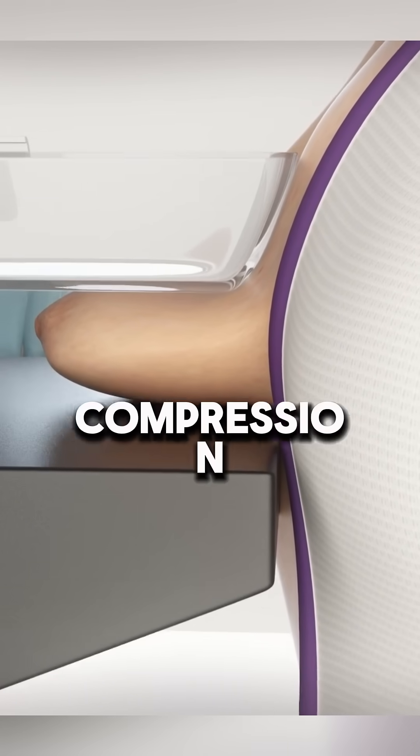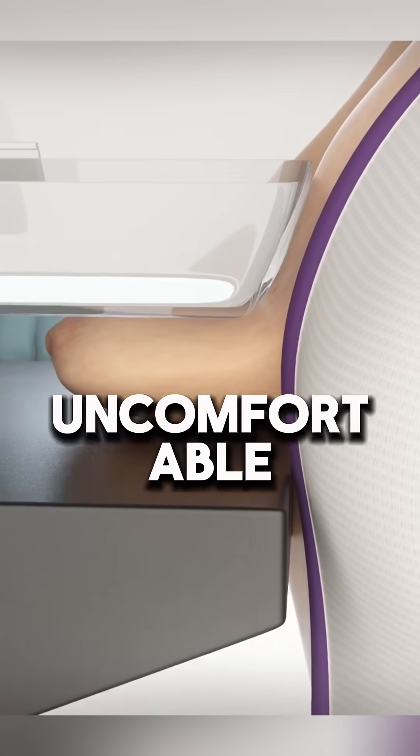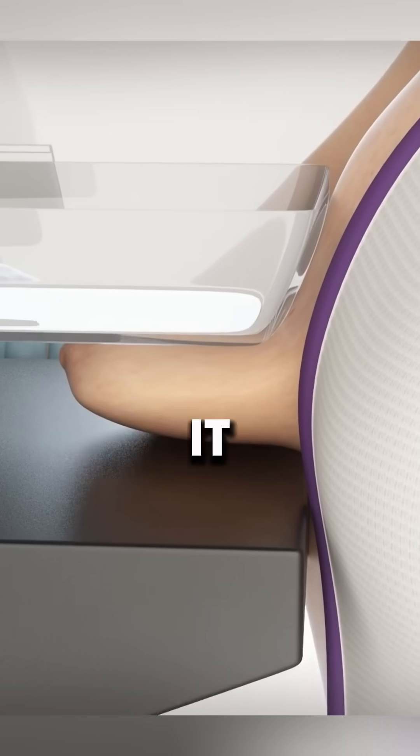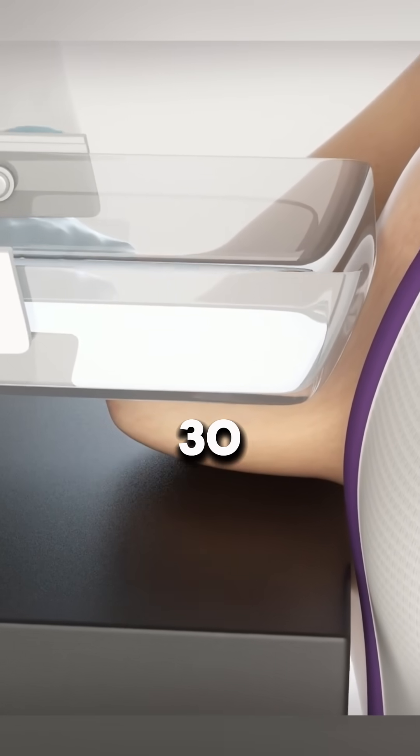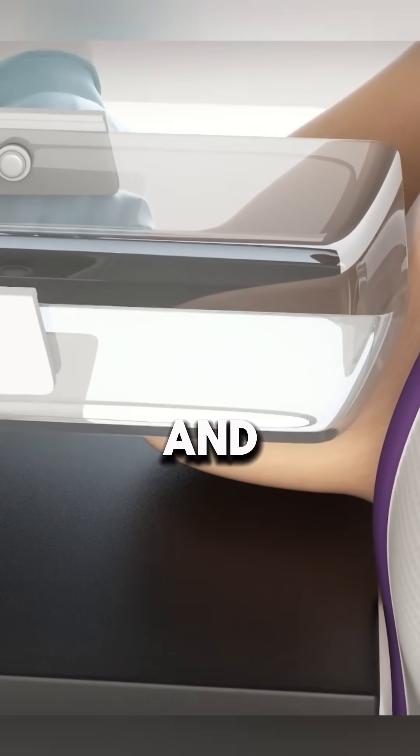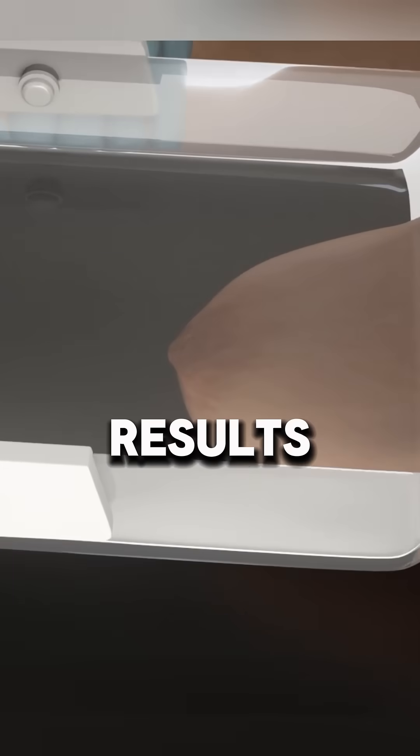While the compression may feel uncomfortable, it only lasts about 20 to 30 seconds and is essential for accurate results.